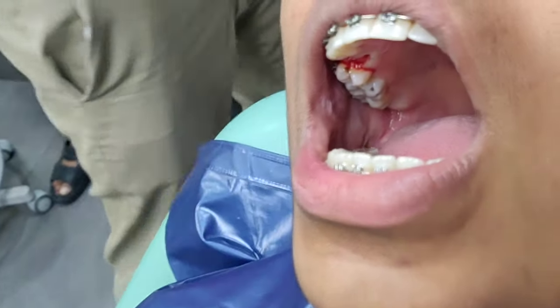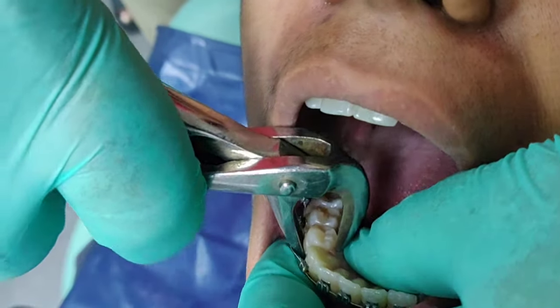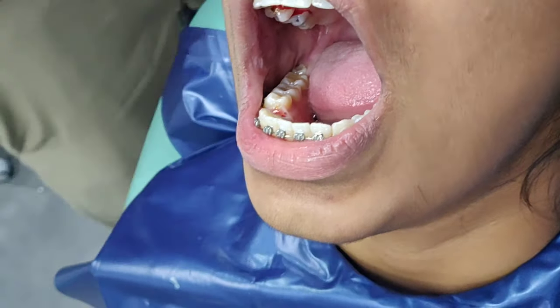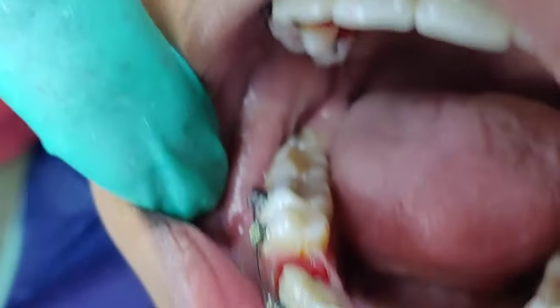For the lower bone, we will not be compressing the bone — just a twist, and the tooth is out. It took just a few seconds to remove the upper and lower teeth, first premolar structure.